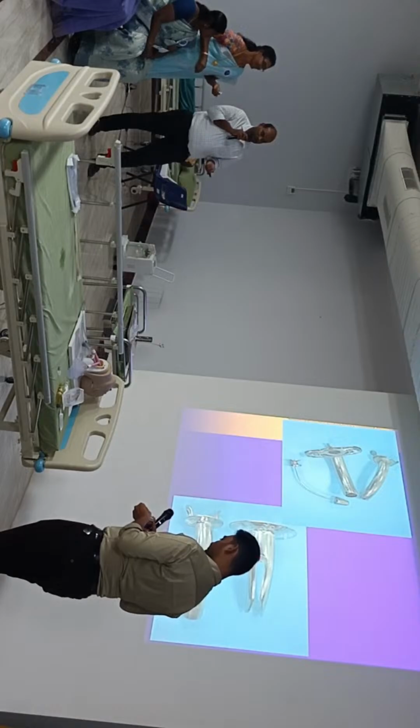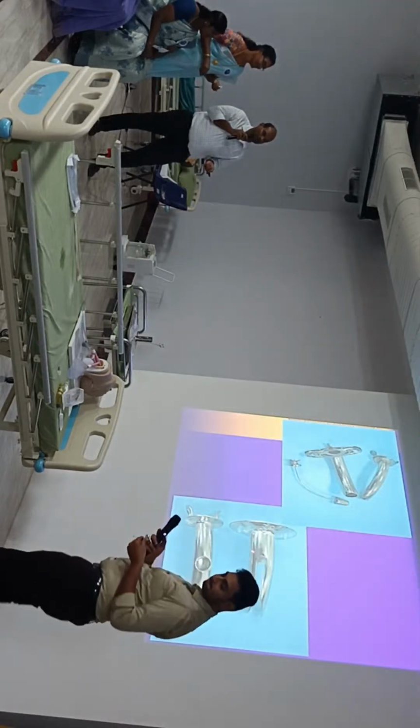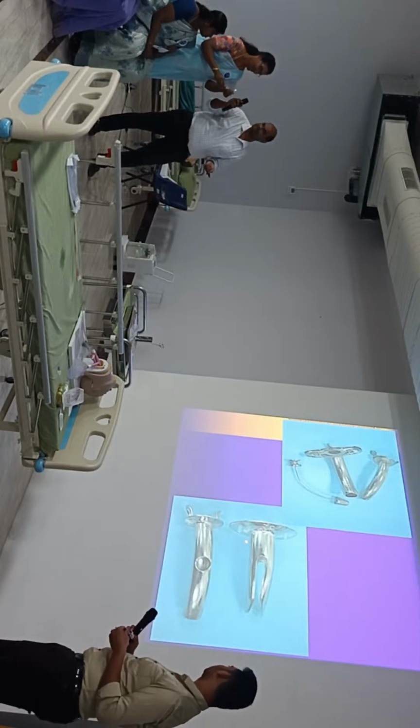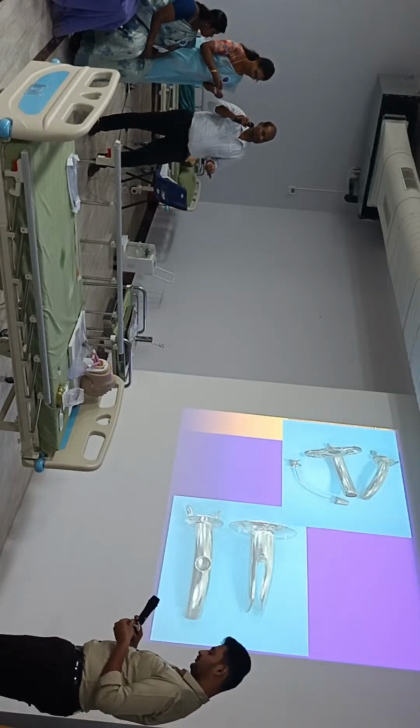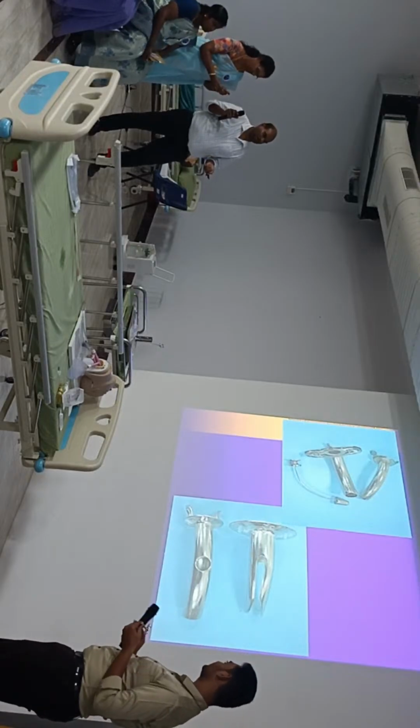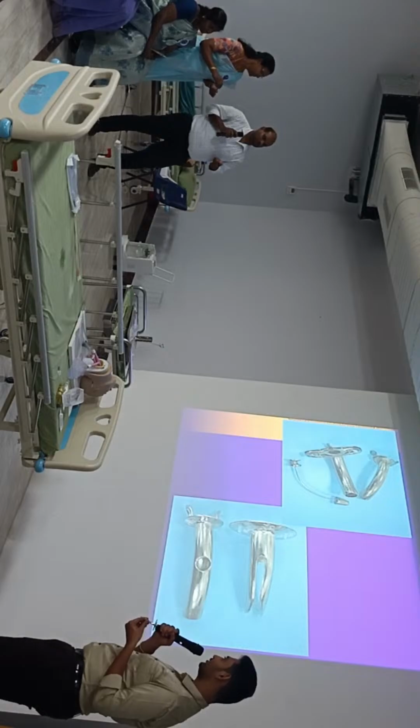This is a Fuller's tube, which has an outer tube and an inner tube. There's a number here. I hope there's a number there also, isn't it? 26, sir.